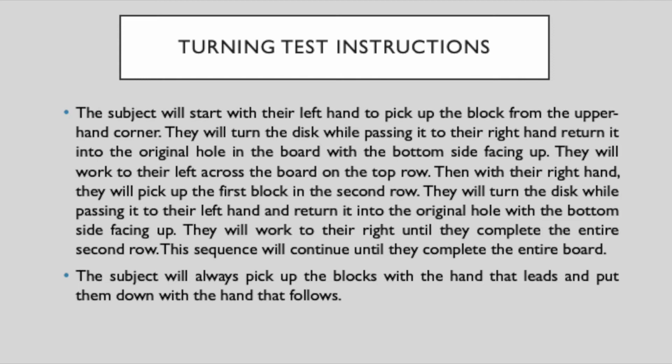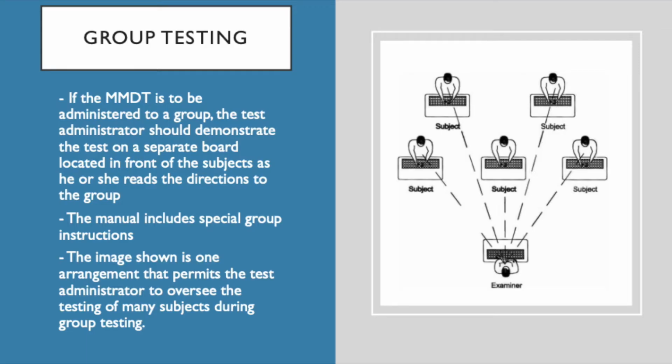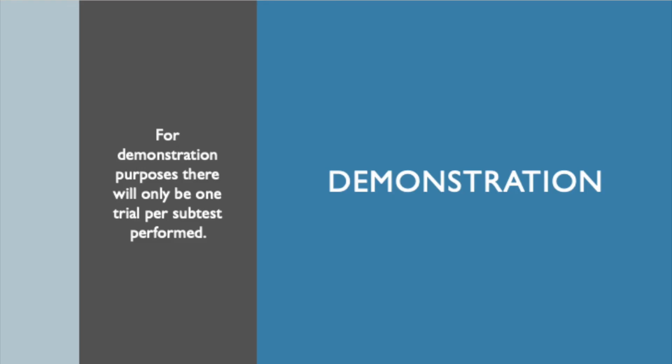If the MMDT is to be administered to a group, the test administrator should demonstrate the test on a separate board located in front of the subjects as he or she reads the directions to the group. The manual includes special group instructions. The image shown is an arrangement that permits the test administrator to oversee the testing of many subjects during the group testing. For demonstration purposes, there will only be 1 trial per subtest performed instead of 2, 3, or 4 trials.